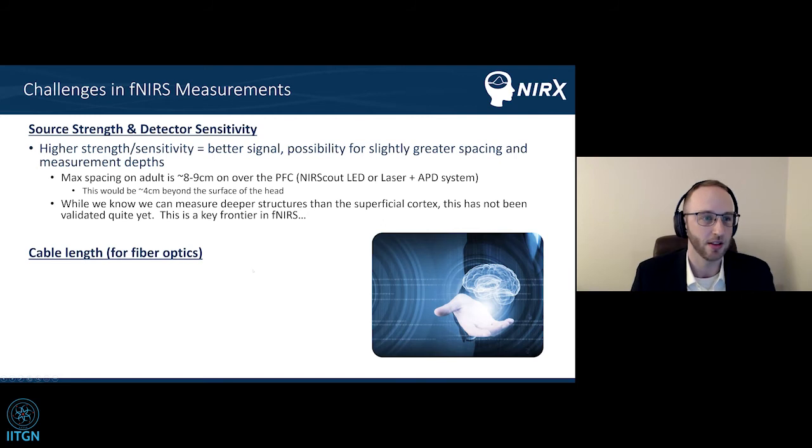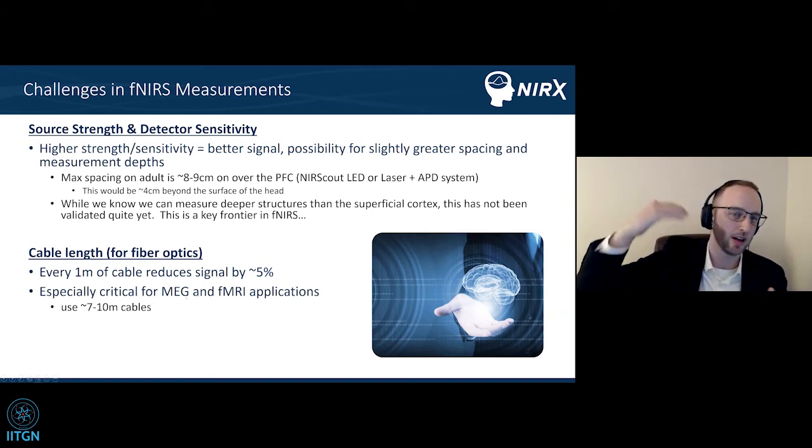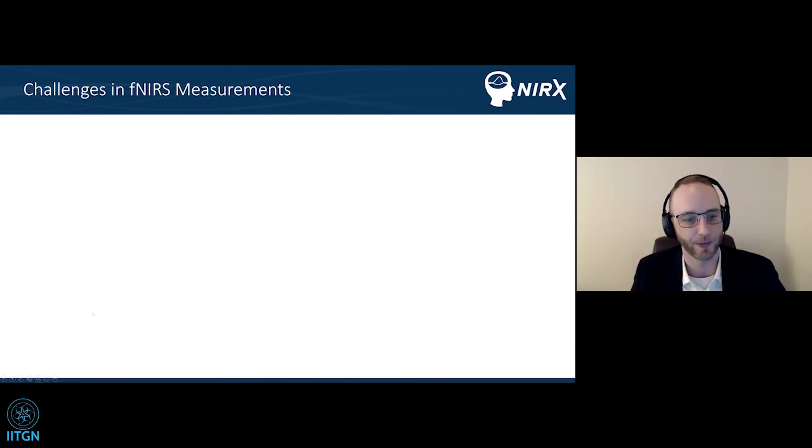Cable length is a factor, especially if you're going to be doing concurrent MRI and MEG studies. That would be just fiber optic cables, not lightweight probes like Mahipal was wearing. But still important to recognize when you're using fully fiber optic glass probes, those do reduce signal. We typically see around a 5% signal degradation per 1 meter. Once you get 7 to 10 meters going in both directions, so from the amplifier through the waveguide to the participant that's lying in the MRI and then back, so going through their head and then back, you have light going that whole direction. You get a lot of signal loss just from that fiber. So again, a reason to have good sources and detectors.